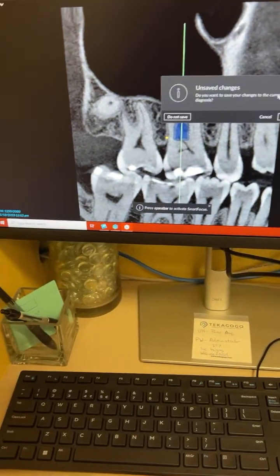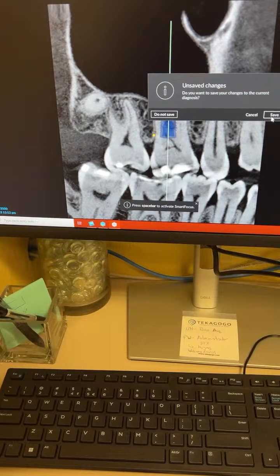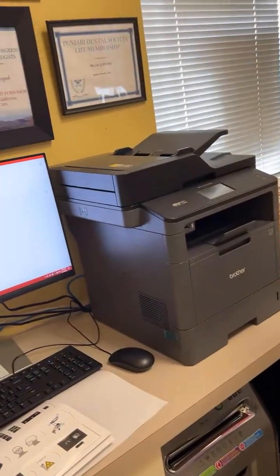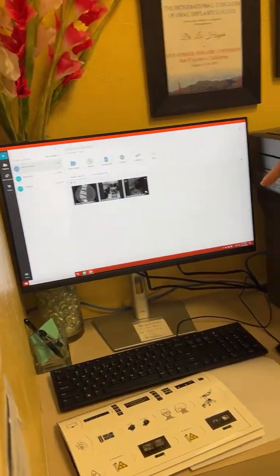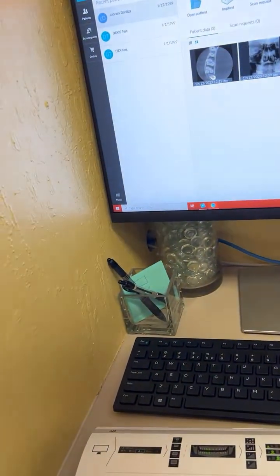So now we've done 3D for them. How about you want to go over 2D? Yeah. Maybe you go 2D, it is pretty quick, so they can go to lunch. Yep, I'll go fast for this. So you know how to go in through EagleSoft. You just did it. Now you're going to choose Pano. Can I go to EagleSoft? No, you go to EagleSoft.